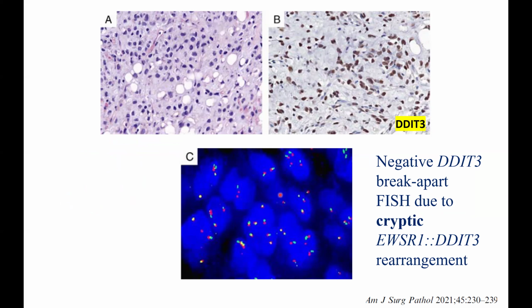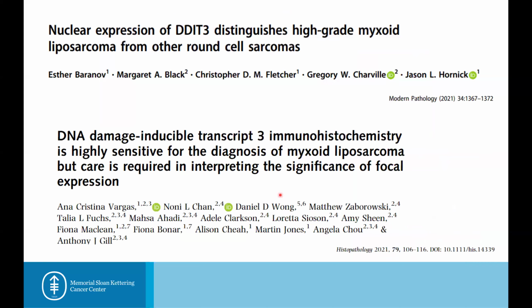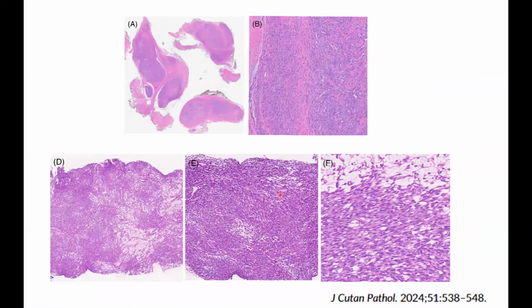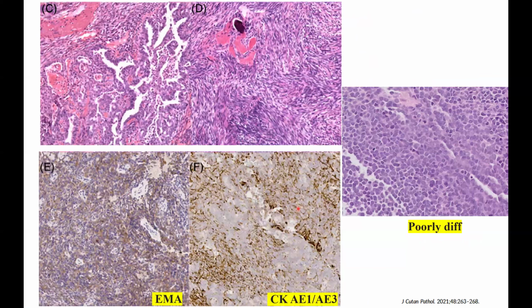In this particular scenario, the immunohistochemical stain works extremely well with a very high sensitivity and specificity. And this is a part of a synovial sarcoma, which rarely can be superficial, or it can be the tip of the iceberg for a deeper tumor growing up superficially. And this is your characteristic, very monomorphous spindle cells with eosinophilic cytoplasm and inconspicuous nucleoli. Sometimes it can have a biphasic or monophasic appearance, but sometimes it can be really poorly differentiated, resembling basically any poorly differentiated tumor.